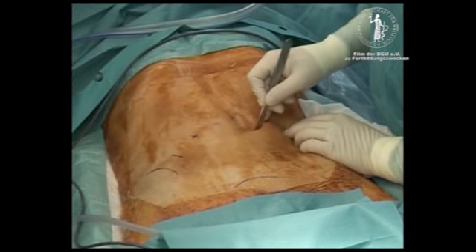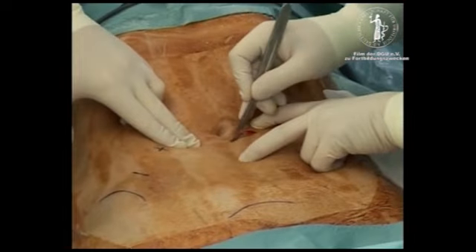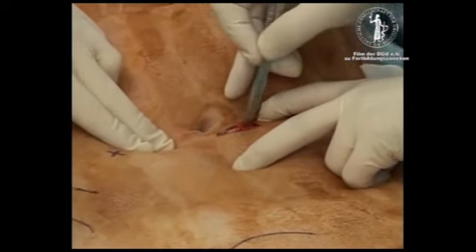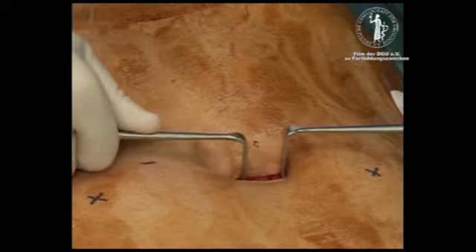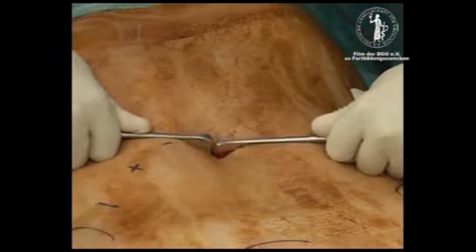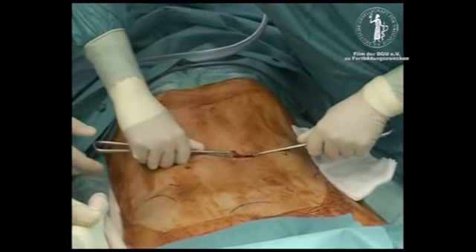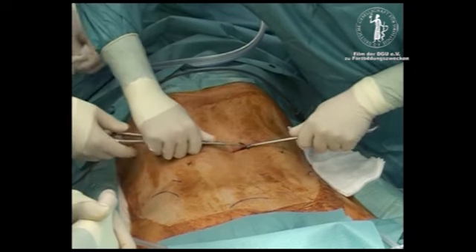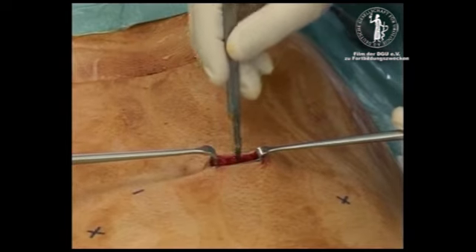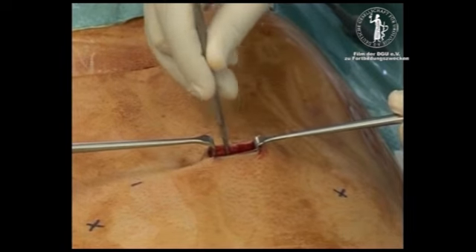The skin is incised over 2 cm transversely just below and to the left of the umbilicus. With 2 Langenbeck retractors, the anterior rectus fascia is freed from the fatty tissue. The anterior rectus sheet is incised vertically over 1 cm.